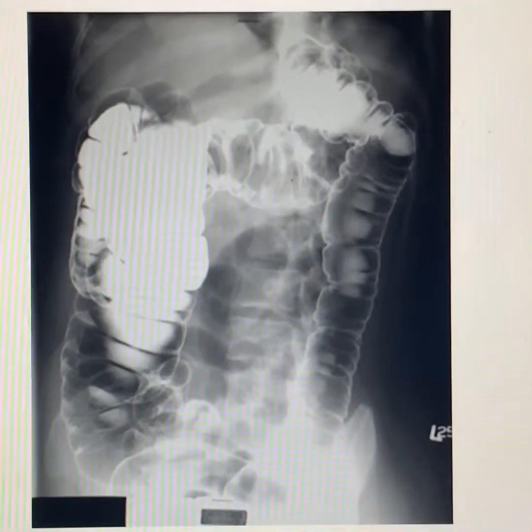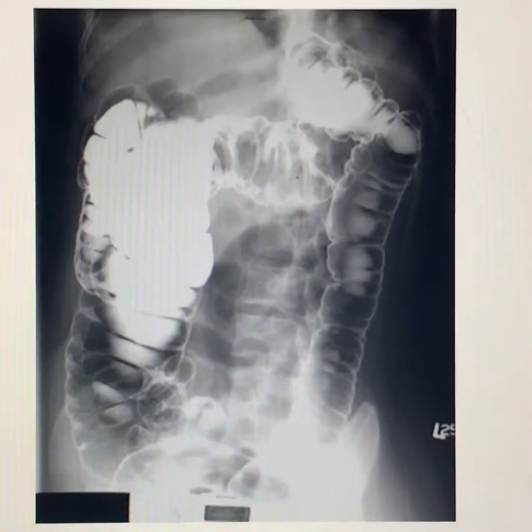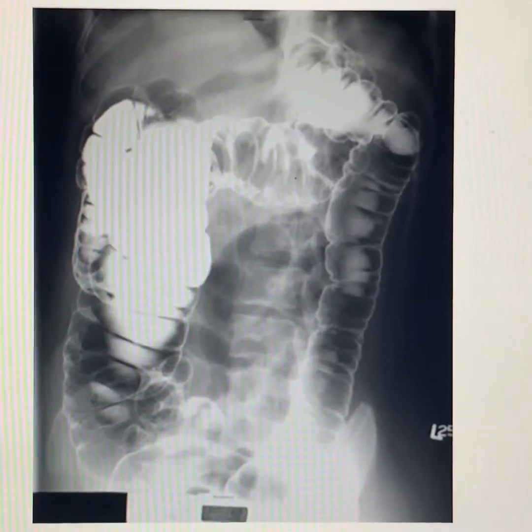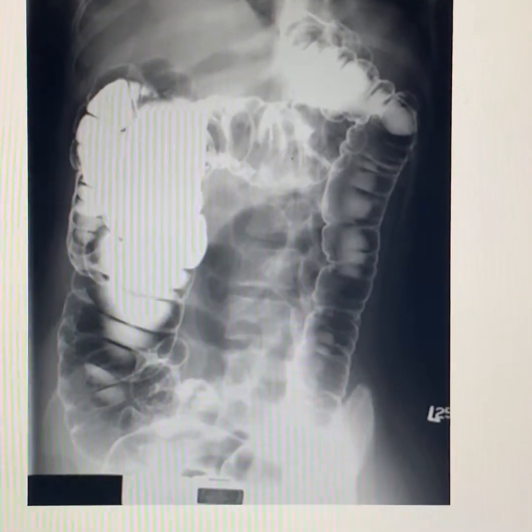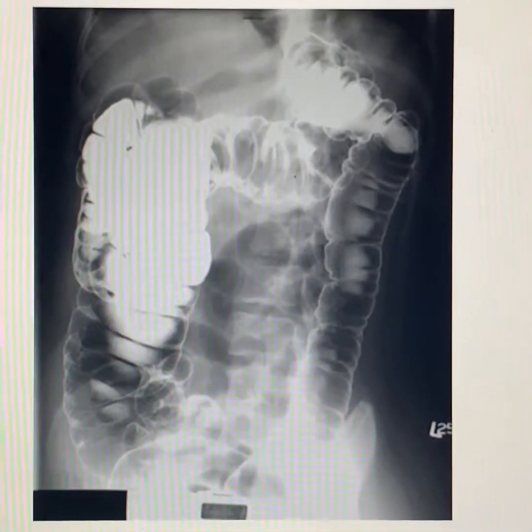Here we have the patient LAO position. Central ray is 1 to 2 inches from the midline from the elevated side at the level of the iliac crest. Patient's prone but rotated 35 to 45 degrees. The left colic flexure is seen and will be the one less superimposed over the right.